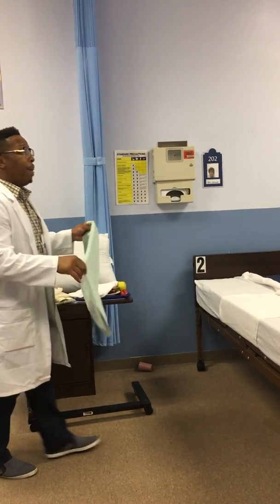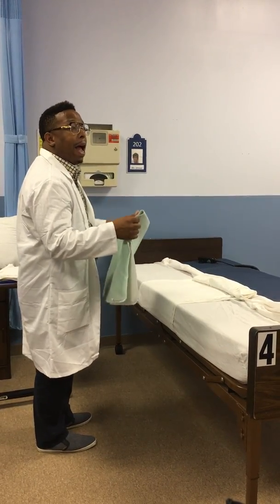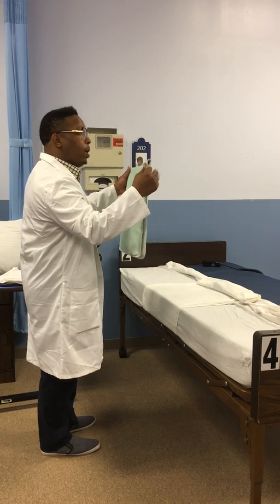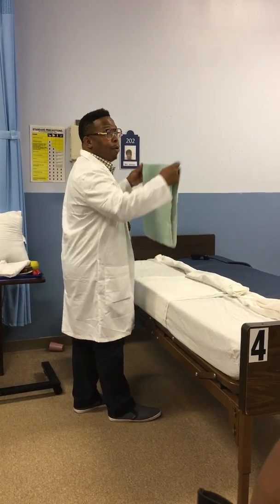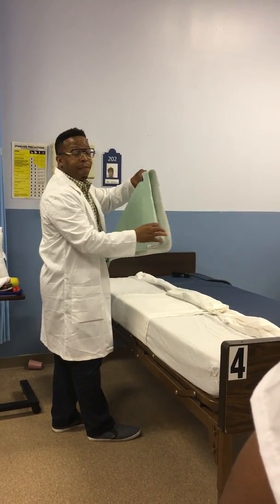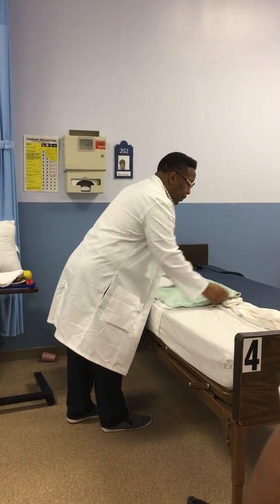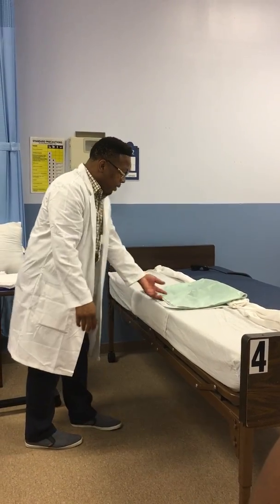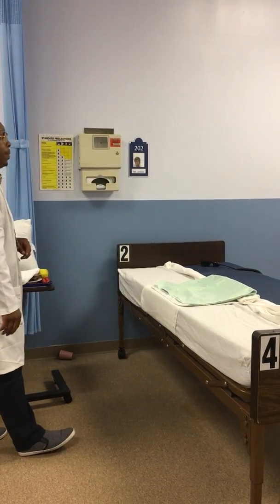The bed pad. The bed pad is typically used so if patients are incontinent, or even if they're continent, they pee or poop, it can hopefully fall on this bed pad. So I'm putting anything directly in the middle of the bed, and again, flaps are on the outside. Do you notice what I say when I say flaps? On the outside. How many flaps y'all see? 2. So you have to roll up half. How many am I rolling up? 1.